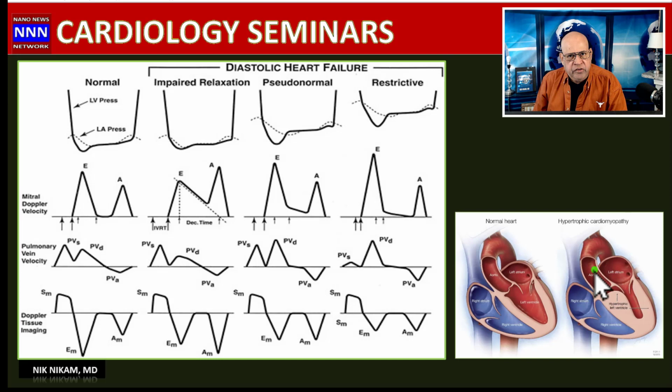As we can see, patients with diastolic dysfunction have hypertrophic cardiomyopathy. They could also have infiltrative cardiomyopathy, or restrictive cardiomyopathy due to constrictive pericarditis. In most of these conditions, there is impaired filling of the left ventricle during diastole. That's what's reflected in all these Doppler studies.